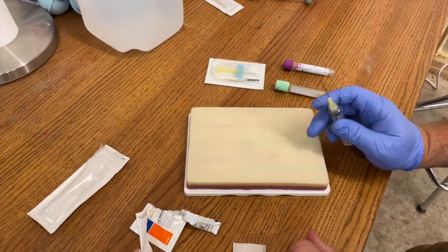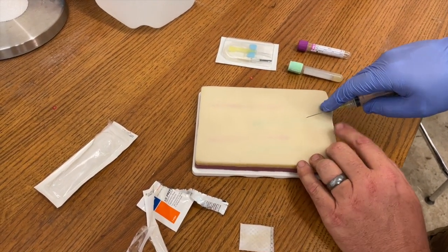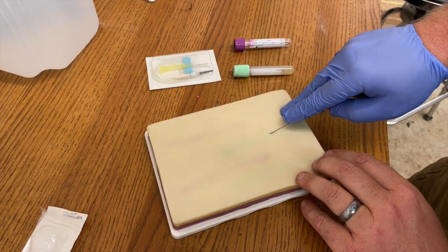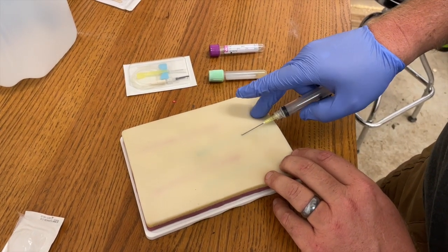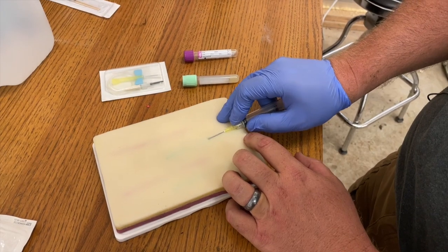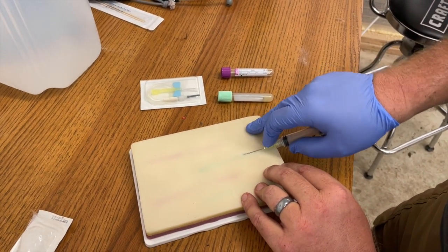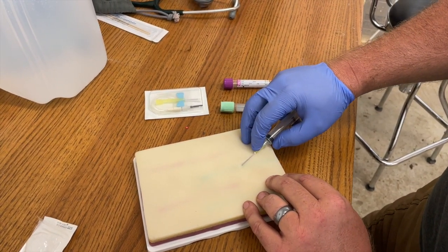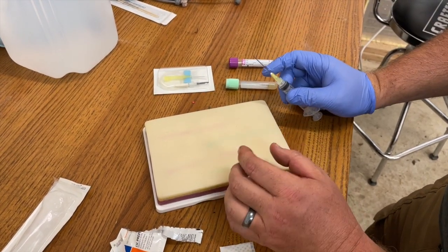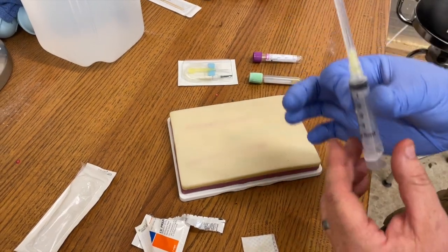There are times some of you may be tempted to reuse needles — when you're doing a vein access, I do not want you to reuse needles. So again: 20 to 25-degree angle, bevel up, advance the needle. You'll feel a pop or you'll see some blood start to fill up in the tube. Rock back, advance the needle further, and go ahead and draw back. If you don't get any blood return, you may have to draw the needle back, move it to the side a little, whatever you need to do to get access to that vein. You may have to fish around a little bit. Although the jugular vein is very, very large, and as long as you're over it, you should have no problem getting blood out at all.